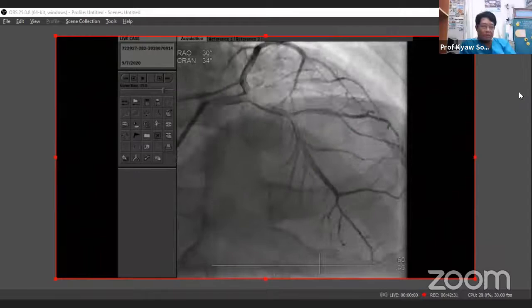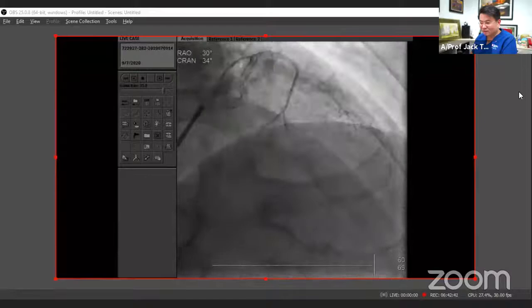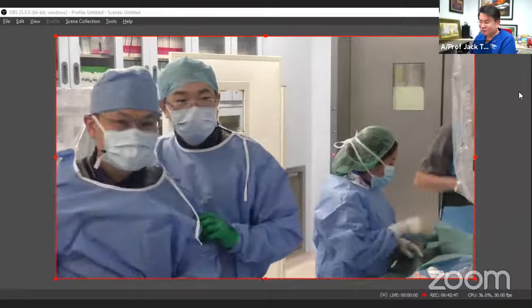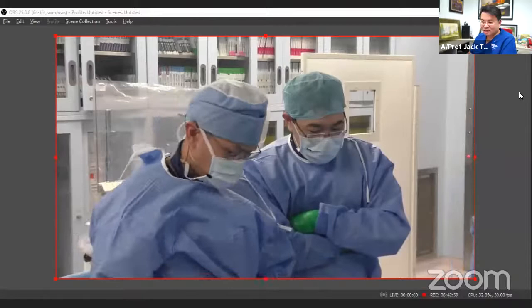Thanks, Dr. Joe. Actually, one of our participants, not a fellow, Dr. Paul Ong, asked very good questions. Maybe I'll defer Paul Ong's question to someone else. He feels that proximal versus distal wire crossing has no difference since both ostia are completely covered by the stents. And also, he asks, is there any disadvantage in this type of case to stent right to the left main ostium?